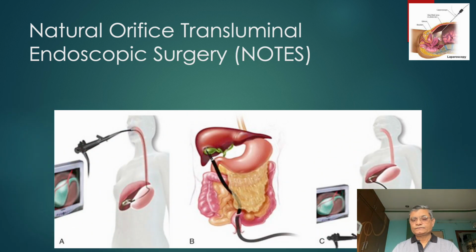NOTES stands for natural orifice transluminal endoscopic surgery. Here the access is through either mouth or anus or through vagina.